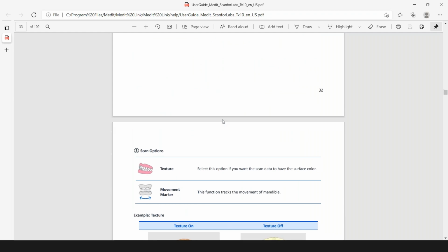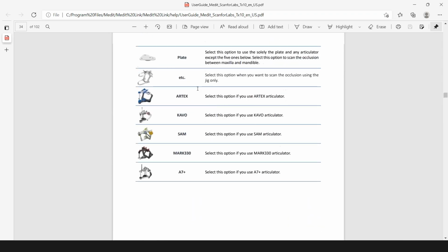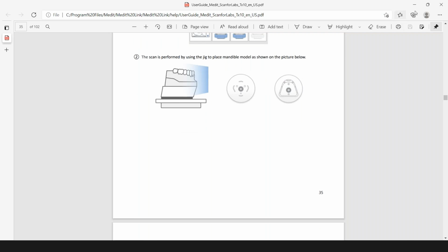You can go ahead in here and check the user guide, and it'll explain the process for you. This is what I was looking for. I wanted to show you, remember we had that pink icon in the initial setup window where it shows texture on and off. So basically one with color and one without. Got it. Different types of articulators, things like that. Perfect.